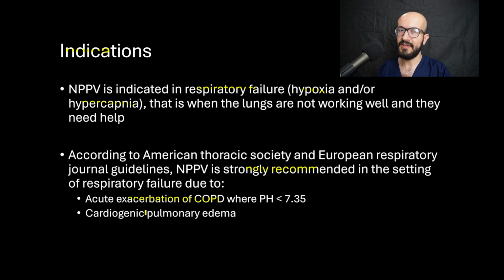Now NPPV is also strongly recommended in cardiogenic pulmonary edema.